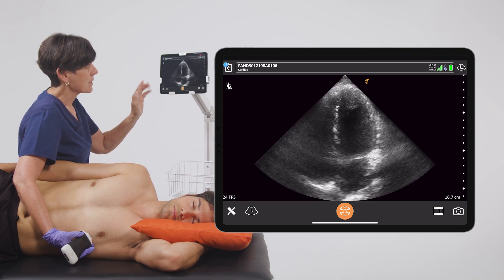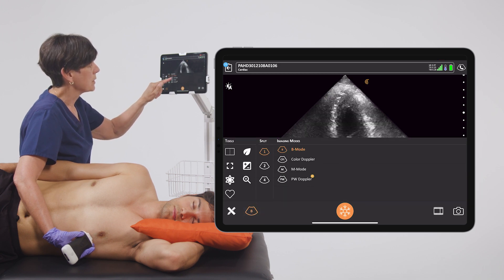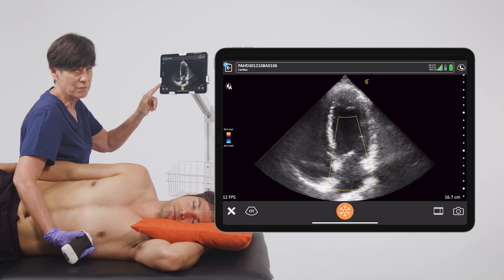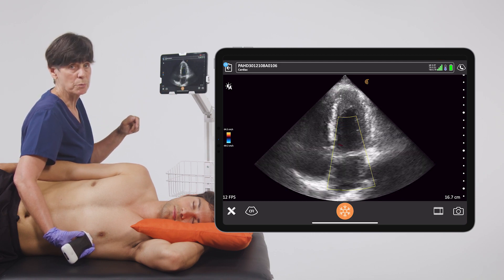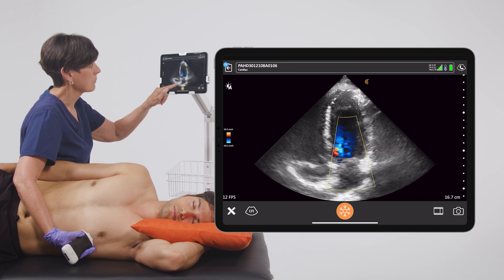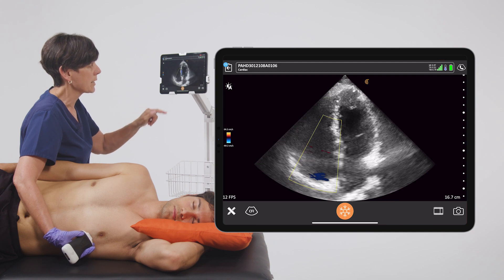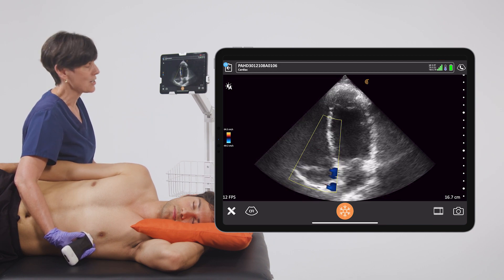Once I've assessed how well both of the ventricles are pumping, I can enter into color Doppler and place the color box by dragging my finger over the mitral valve where we can look for mitral regurgitation. And when we're satisfied with that we can drag the color box over the tricuspid valve to assess for tricuspid regurgitation as well.